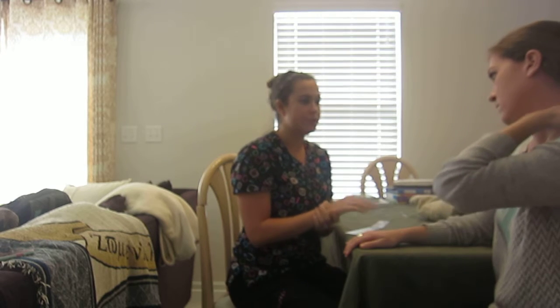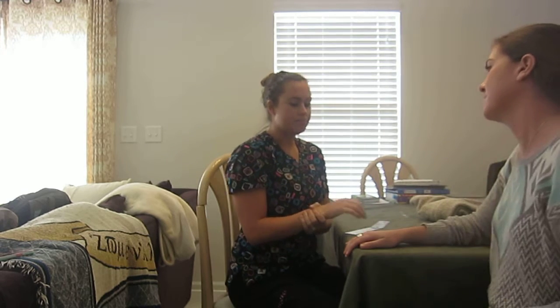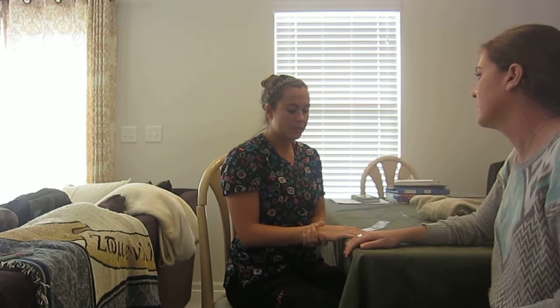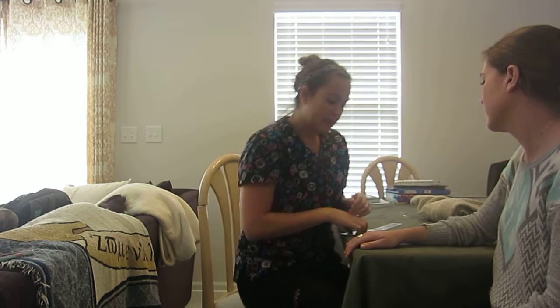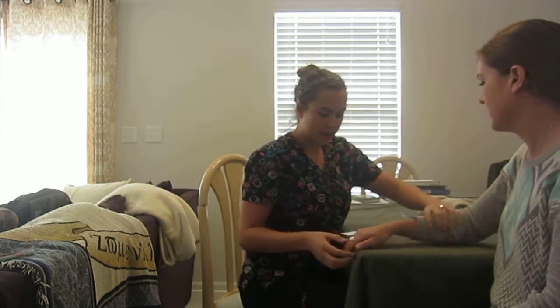So from what I understand, you're coming in because you've had an injury to your right wrist. Okay, so today we're just going to be doing some range of motion measurements to see if you have any limitations or stiffness so that we can use that information for further treatment. Is that okay with you? Yes.